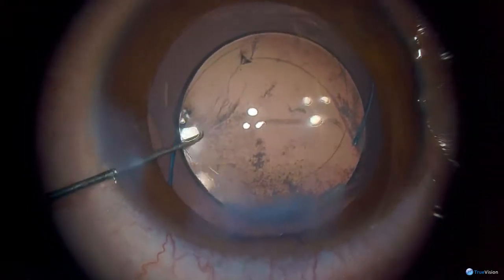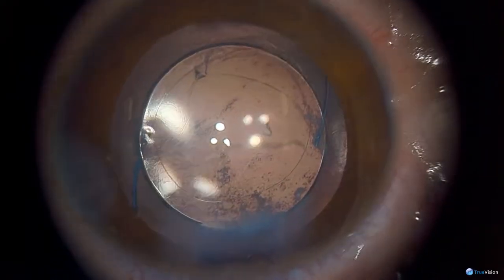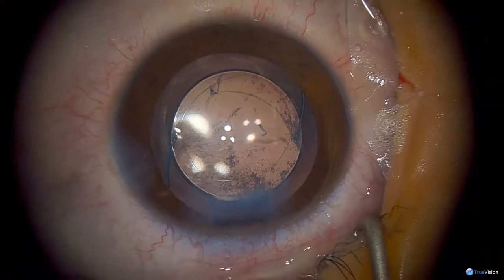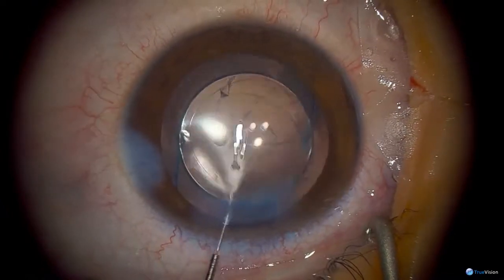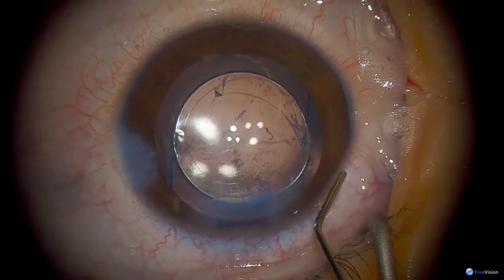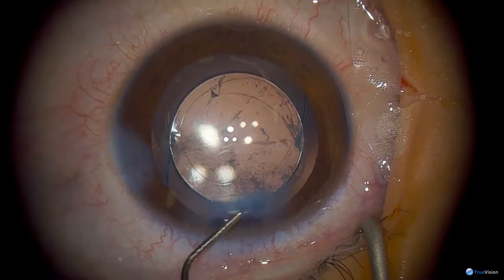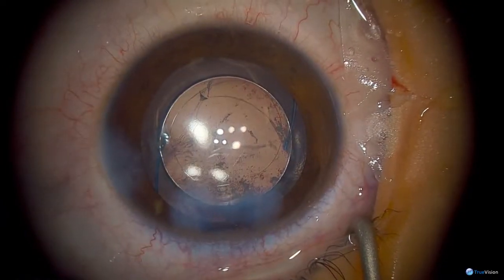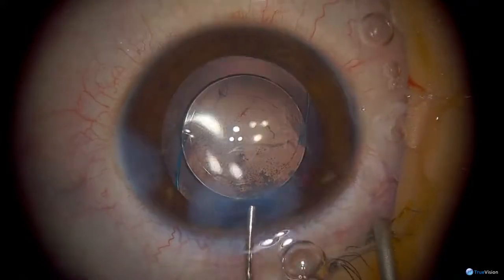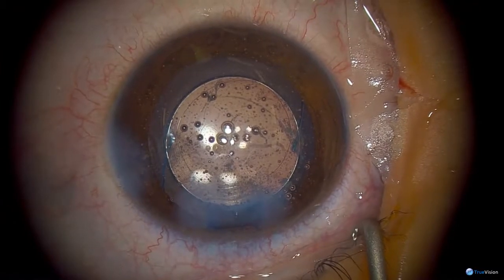How old is the patient? Seven years old. So he either had a congenital defect in his posterior capsule or he must have had trauma. That was why he had a cataract in this eye — he's obviously got a tear in his posterior capsule. Do you think this is a congenital condition? My guess is it might have been due to trauma because firstly his mother said the cataract came on very quickly, and secondly the other eye is completely normal. There's no other reason I could find for the cataract, so a recent trauma would explain everything.